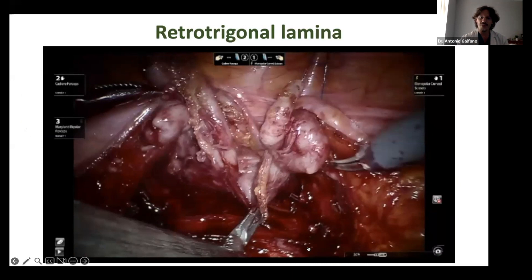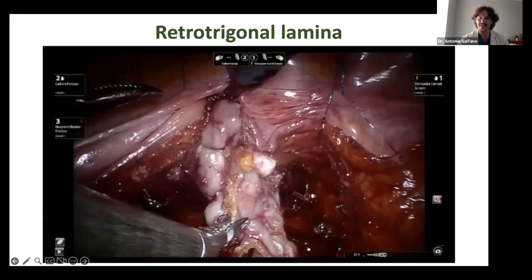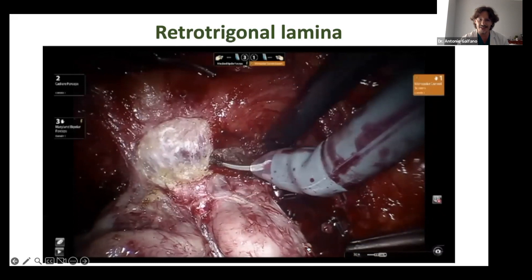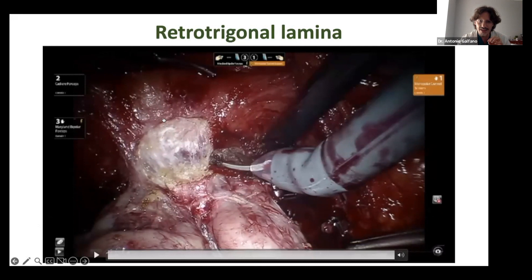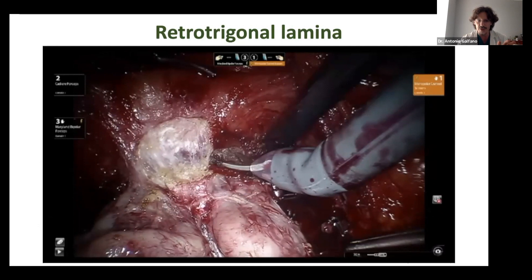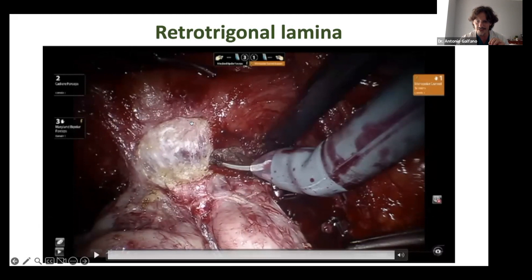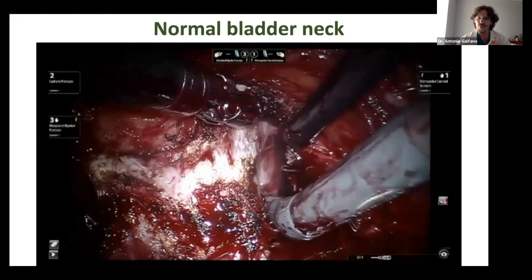Starting with the video: the first anatomical landmark that is important to understand is the retrotrigonal layer — exactly this tissue that you grab from anterior when you do the posterior reconstruction of the Rocco stitch. This is bladder, these are seminal vesicles, but this will be the layer that we grab with the needle when we do the Rocco stitch from anteriorly.